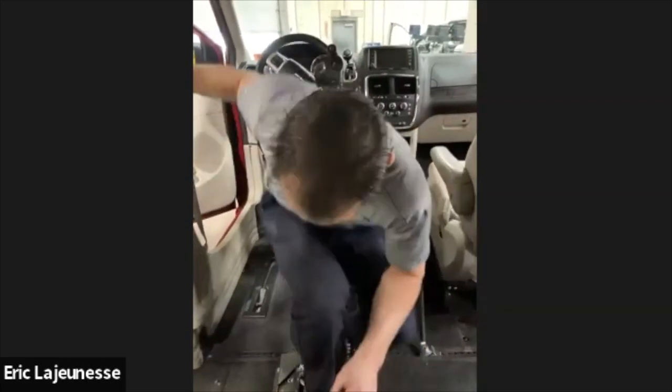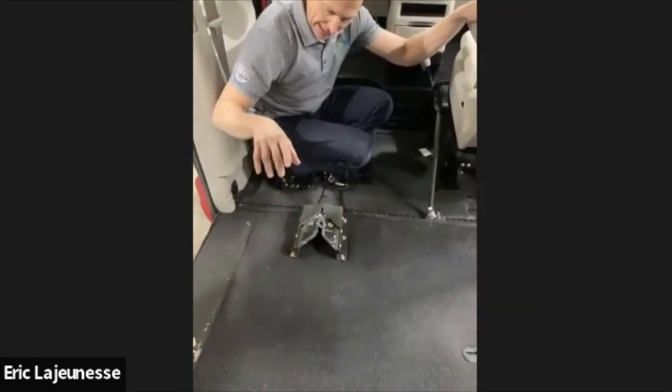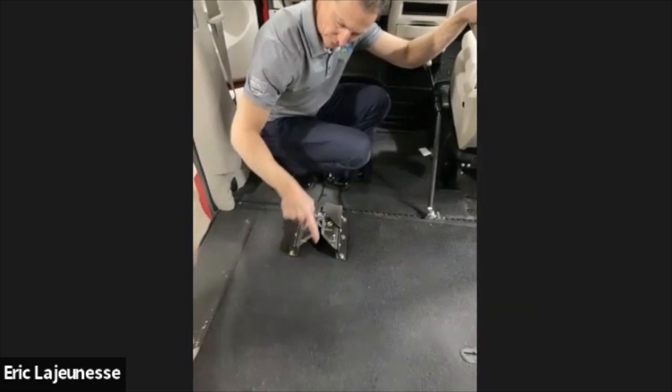Okay, great. The next question is, what is the manual wheelchair lockdown called? I think that's the question. Did I read that correctly? Okay, so you can use the system that I have here. You can use a bracket that goes on a manual chair with a pin.